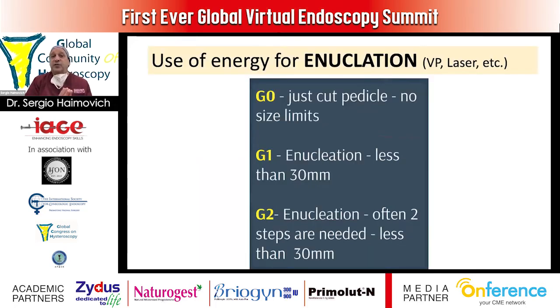And the last is the use of energy for the enucleation of the myoma in hysteroscopy, the same as in laparoscopy. So you can use VersaPoint or laser, it doesn't matter.